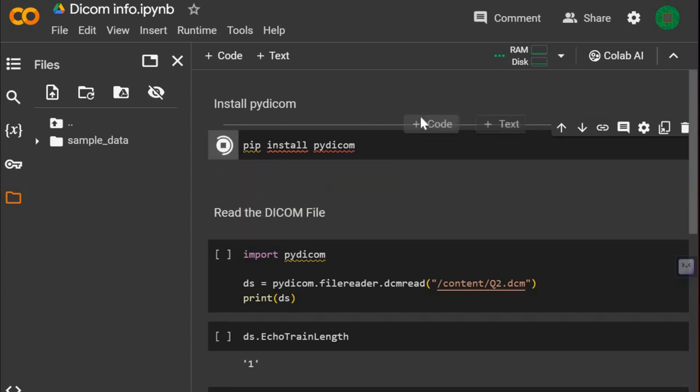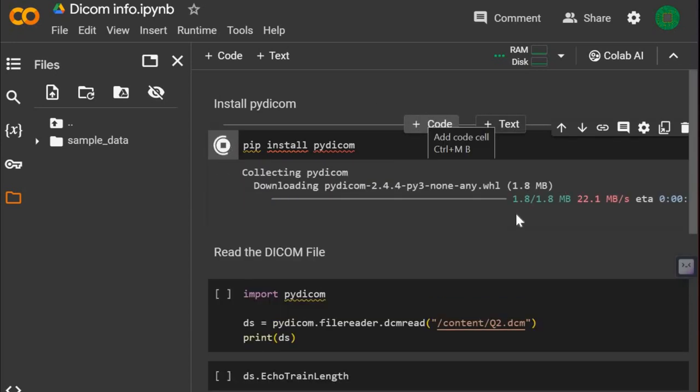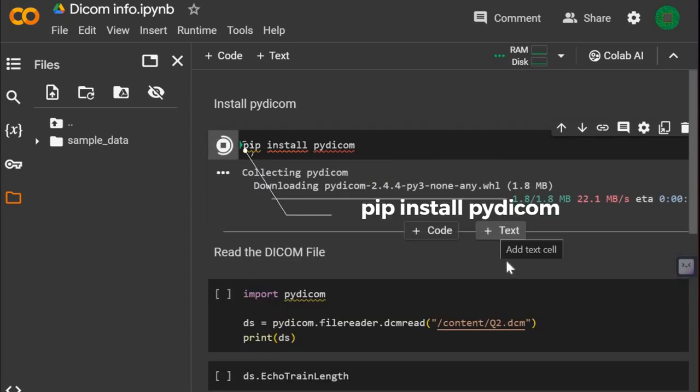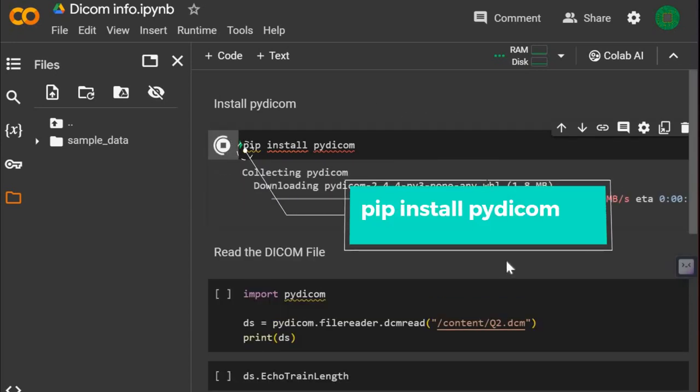To find the DICOM info, we will first install PyDICOM library using pip install command.